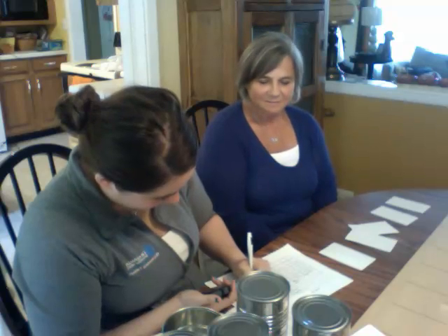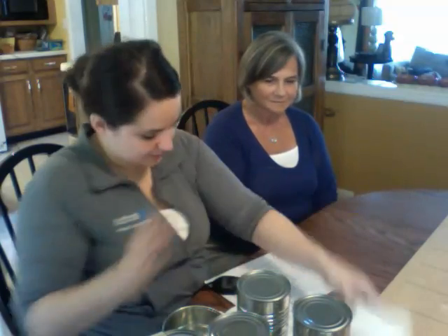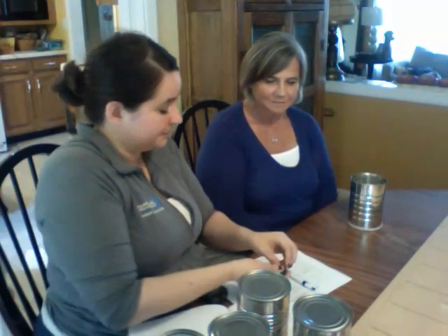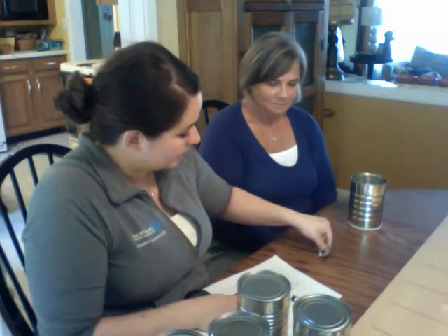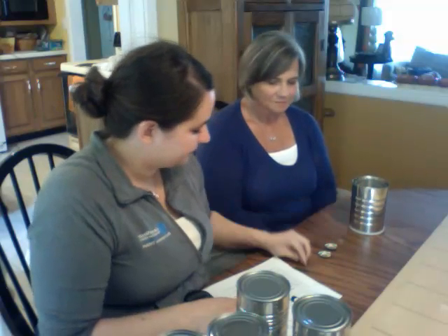Good work. All right, let me set up the next one. Our next test is called the Small Objects Test. And we're going to place this can right in front of you. And we're going to start with your left hand again, your non-dominant hand. And for time purposes, I'm only going to do your non-dominant hand on this one, okay? But if we were in a real setting, and I were taking these results and recording them in your medical record, I would do both hands, okay? So again, place your left hand on the table. You're doing a good job.